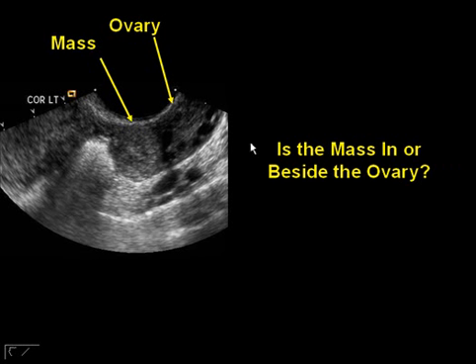Well, one of the important rules or ways to tell the difference utilizes the fact that ultrasound is a real-time specialty. The person doing the ultrasound has the probe in his or her hands and can do things with it. And watch what we can do here. Here is a woman who came in as a ruled ectopic patient. This is the edge of the uterus that was out here, but there was nothing in it. When we look at the left adnexa, we can see the ovary and a mass.